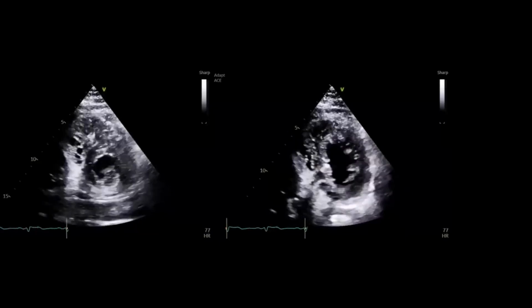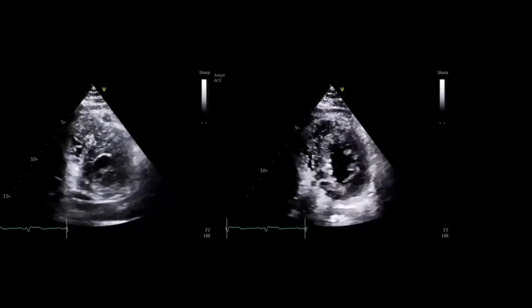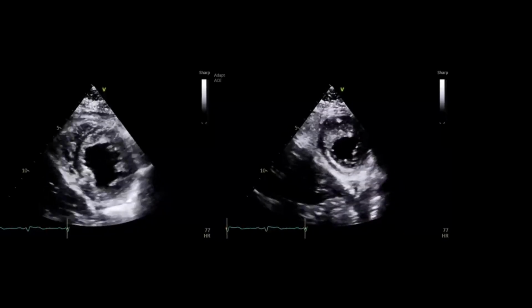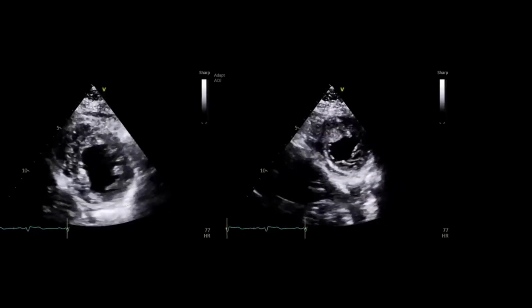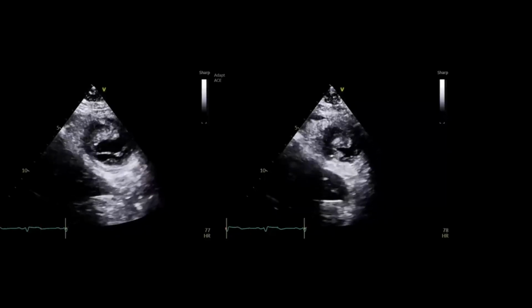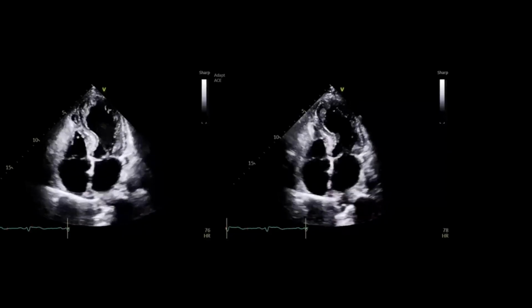These are continuation of the short axis 2D images. You can see good function at the base, and then as we go into the mid, down to the distal segments, significantly hypokinetic regional variability, and then there's also something in that LV there. And this is down to the apex. Yeah, it looks consistent with the stress, very mild.